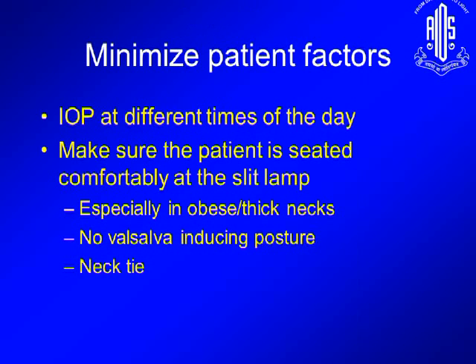So how do you minimize patient factors? You check intraocular pressure at multiple times. You make sure the necktie is not too tight, and in patients with very thick necks or obese, make sure they're seated comfortably at the slit lamp.